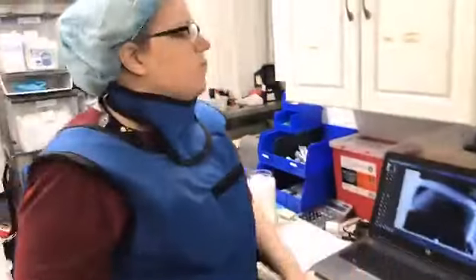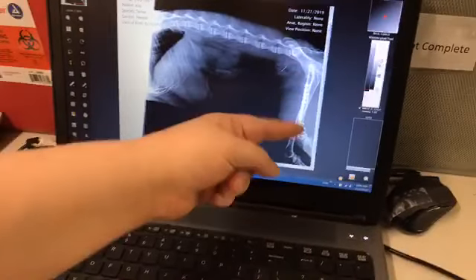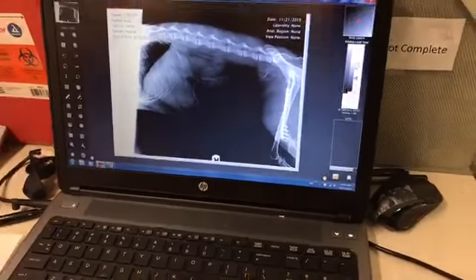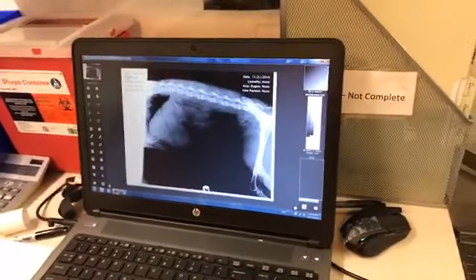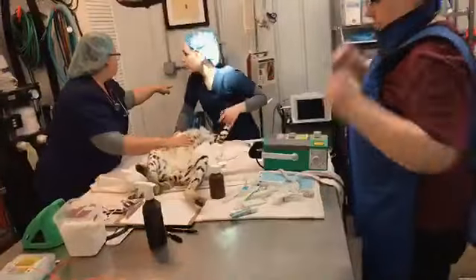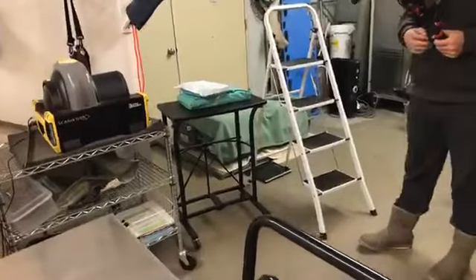Dr. Joanne actually was taking radiographs. Tell us what you found, Dr. Joanne. So Ava has a plate in her left leg at the femur. She has had a broken femur in the past, likely from metabolic bone disease, and it has been plated. We're happy at least it was repaired, but it's sad that even the mother here has had some sort of injury or metabolic bone disease. We know one of the males that is going to another sanctuary from the seizure is pretty much missing part of his front leg due to a horrible injury and metabolic bone disease, because when they have metabolic bone disease, fractures happen so much more quickly because those bones are soft.